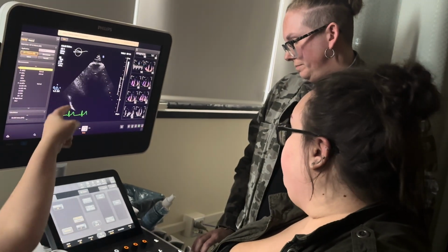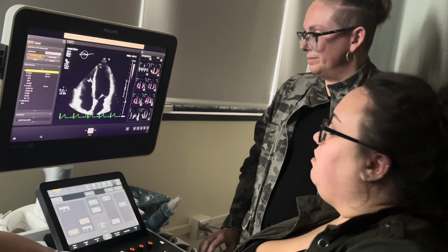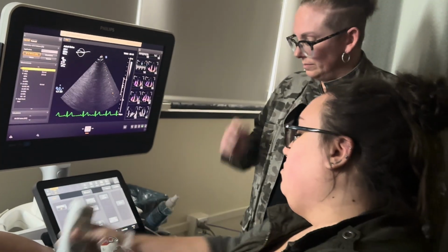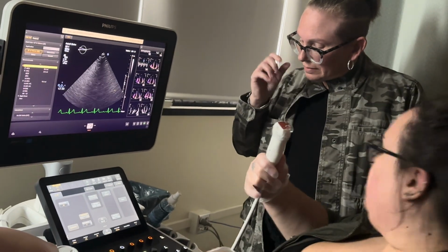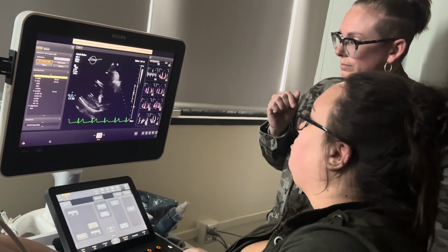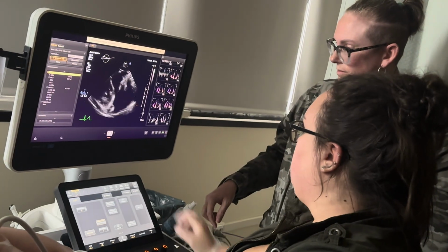All right. My little eustachian valve. Let's show everyone the eustachian valve because she does have a cute one. Okay. Was she the one that had the Chiari network too? Yeah. Actually, I think that was me that had the Chiari network. I can't remember which one of us. It was one of us. She might have the Chiari network actually. Oh, yeah.